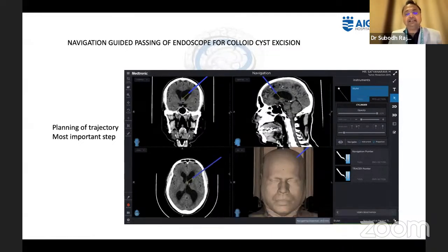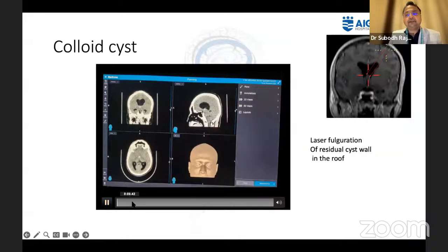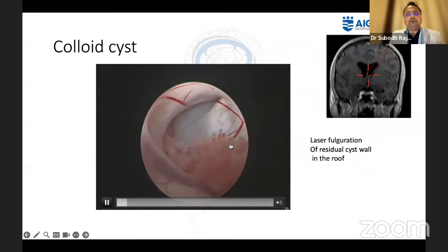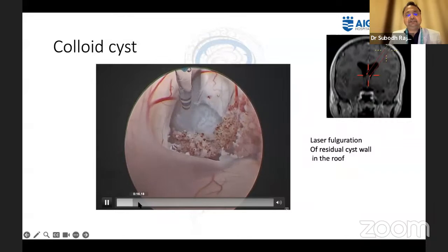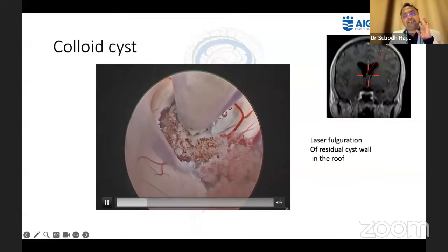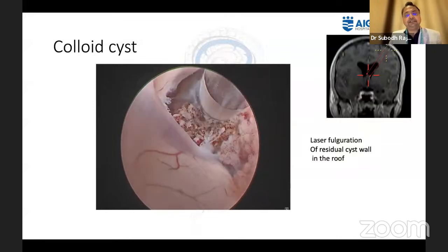This is a ventricle is dilated, especially in relatively smaller ventricles. Using the endoscope is very, very helpful. And this is the view we get. The whole foramen of Monro looks flat to you. It's not oblique or anything. So the same way, the first step, as I told you, and we take the laser to cut and coagulate. The advantage of laser is it can cut and coagulate at the same time. You don't have to use your instruments repeatedly.